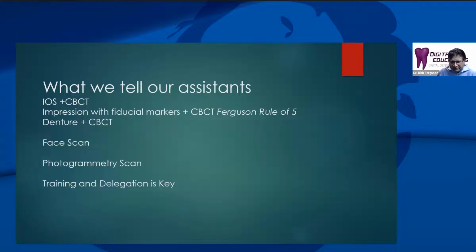And of course, later on, after the implants are placed, we will either do a photogrammetry scan or our conventional impression type technique to make sure that we have the implant positions and the alignment of the implants to each other accurate. And of course, if you're doing an analog approach, you want to make sure that you use a verification jig.